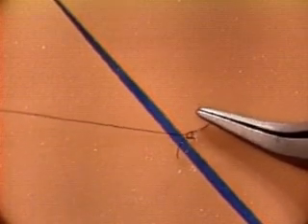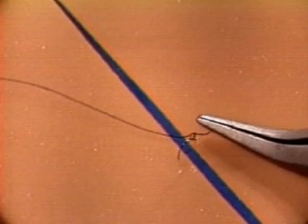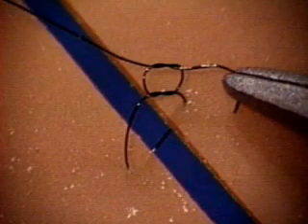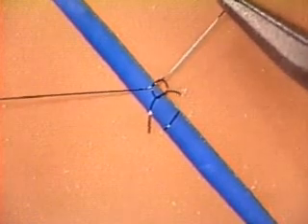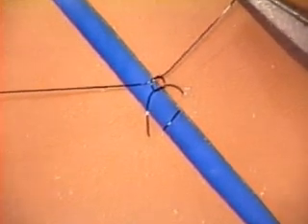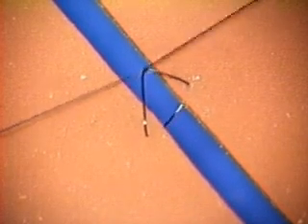I know what you're thinking, just tighten the knot. I will, but there's a problem in getting from here to here. This is what happens. You pull on the 2 threads, and before you get the wound edges together, the knot closes up and locks, and you don't want that at all. There are 2 ways to avoid this problem.